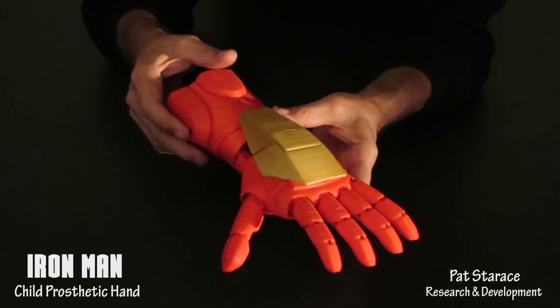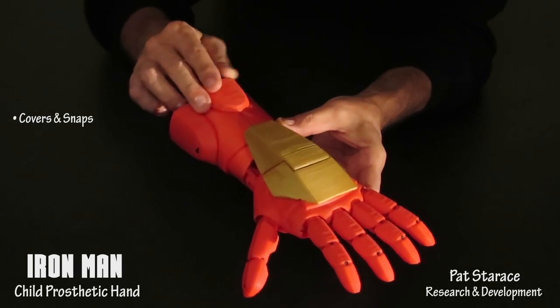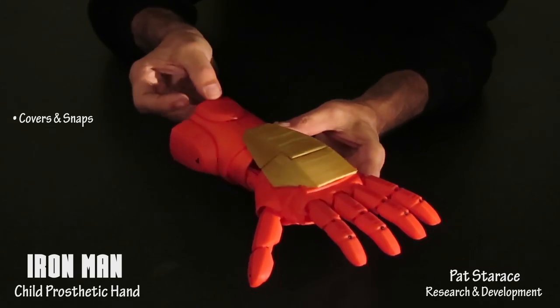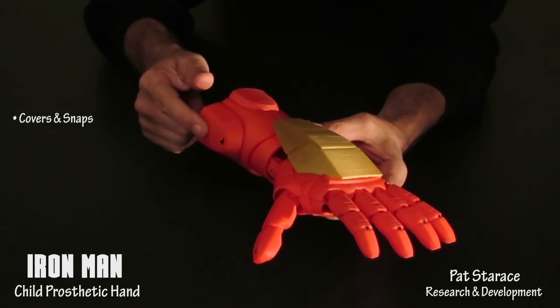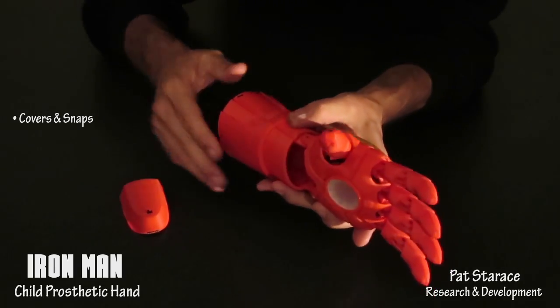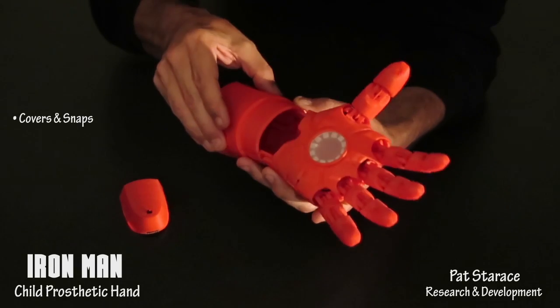On the top of the gauntlet is the cover for the tensioners — it snaps on and off. On the side is the electronics module. To put the hand on, snap off the electronics module and snap off the bottom of the gauntlet.